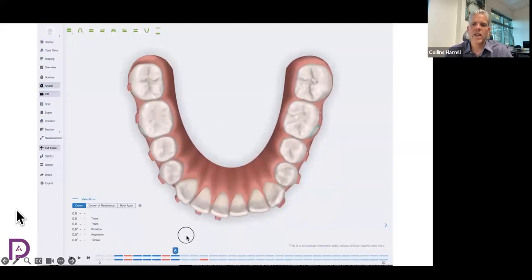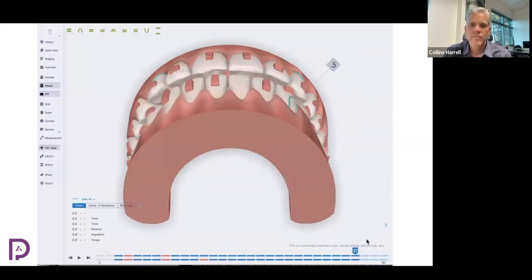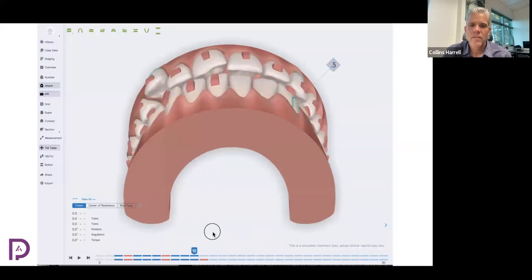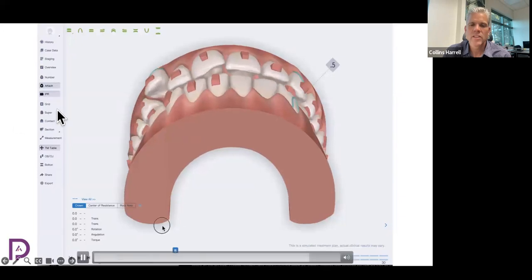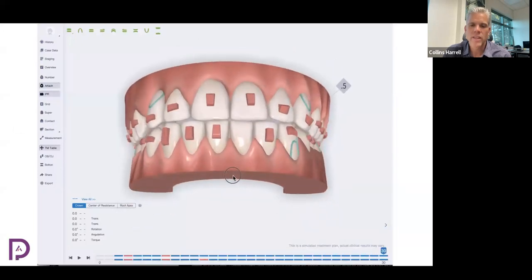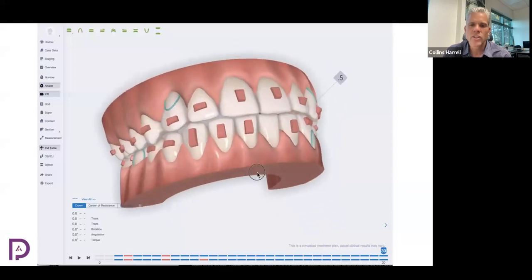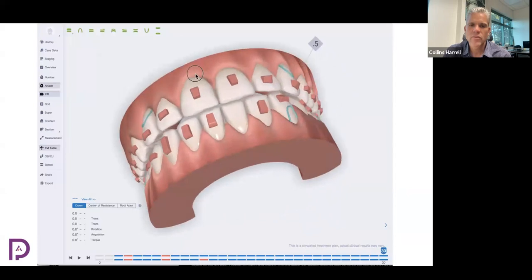Okay, so you're going to evaluate, analyze the second setup. Okay, this looks like a better setup because I don't see collisions. Things are moving in a way that's going to work out well. So this was just one change. And then we have a really nice looking setup.